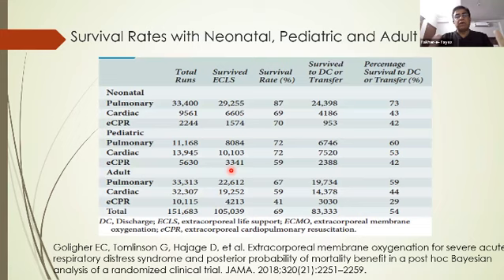So why do we want to put the patient on the ECMO when there are cost issues and recovery issues? We say the selected patient should be placed on it, and there should be some kind of hope of recovery. So it is basically based on 2 trials. One is the CESAR trial, and the other one is the EOLIA trial, where we have seen that not many patients survived after having this much diseased lungs or heart.